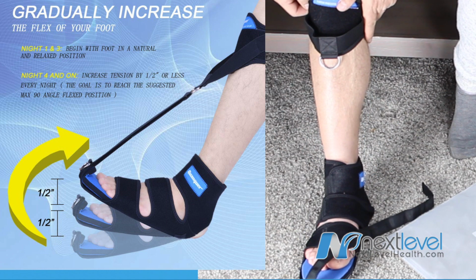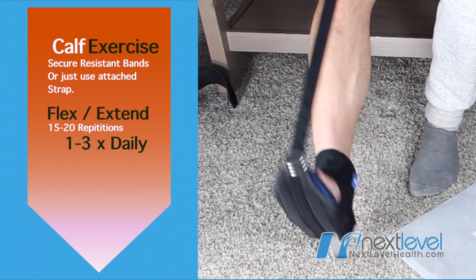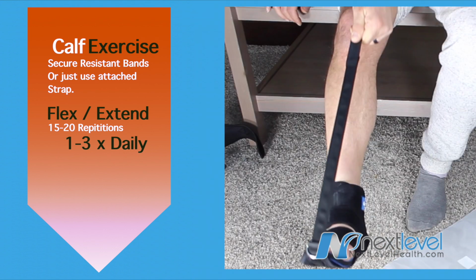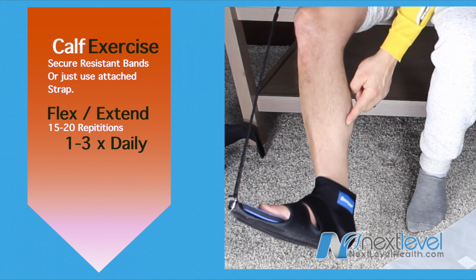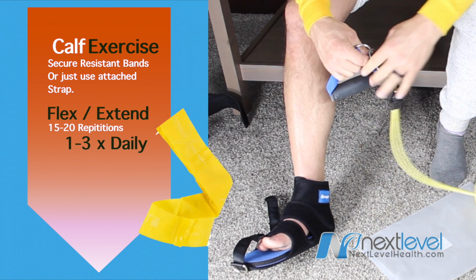And while you have your plantar fascia brace on, I actually want you to do some circulation exercises. You can also do a bit of stretching simultaneously. So this thing is actually very universal. So stretch, strengthen, circulation exercises by finding some resistance TheraBands.